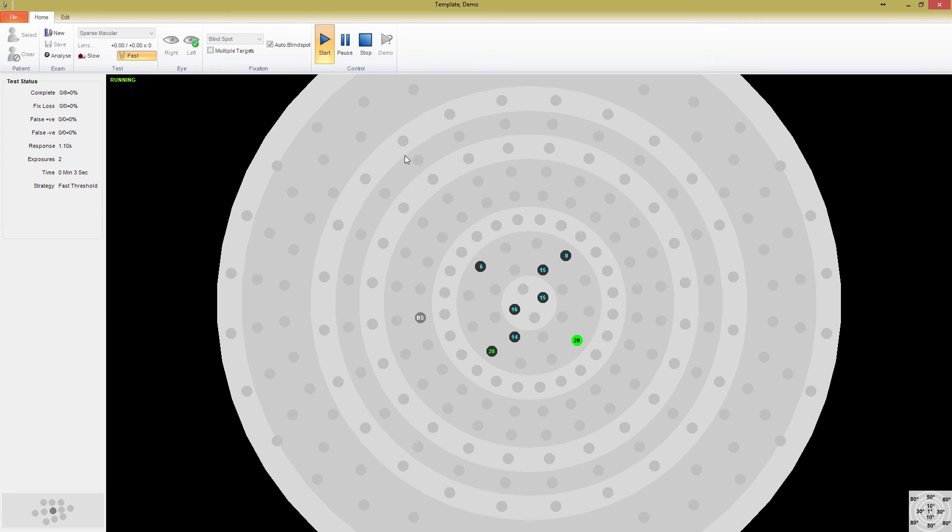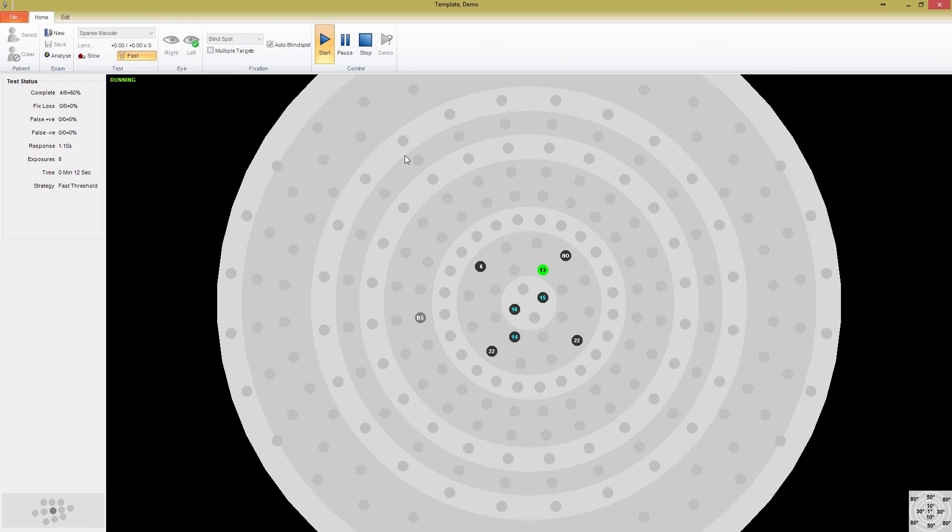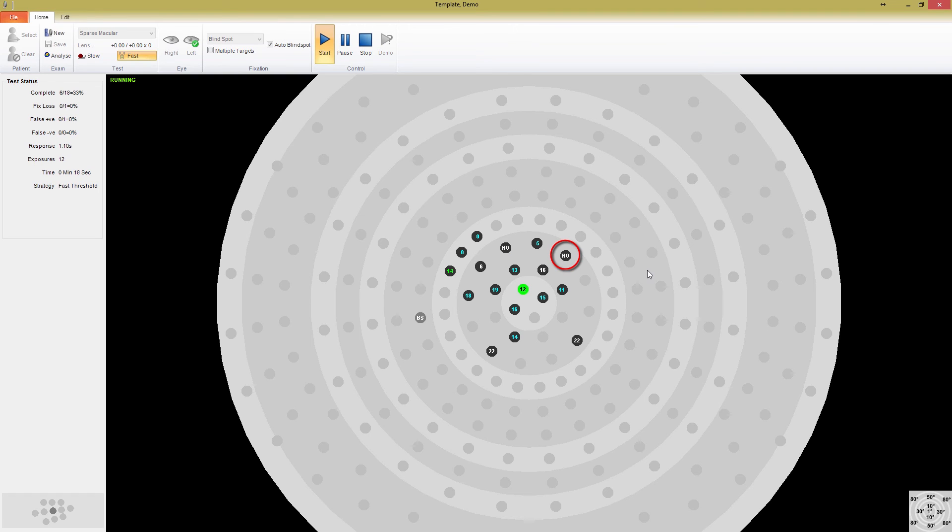The first thing Medmont Studio does is fully threshold 4 points, to use that data in setting the remaining starting exposures. As we approach completion of 4 points, notice a no in the top point, as well as a fairly low threshold in the central points. Now that the 4 points are complete, you can see that all of the surrounding points have been added in areas of reduced vision.